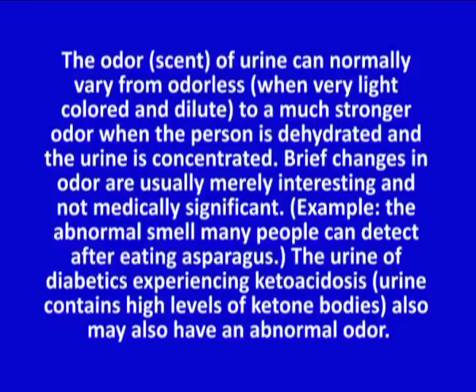Now, odor. The odor of urine can normally vary from odorless when very light colored and dilute to a much stronger odor when the person is dehydrated and the urine is concentrated. Brief changes in odor are usually merely interesting and not medically significant. Example: the abnormal smell many people can detect after eating asparagus. The urine of diabetics experiencing ketoacidosis, that is, urine containing a high level of ketone bodies, also may have an abnormal odor.